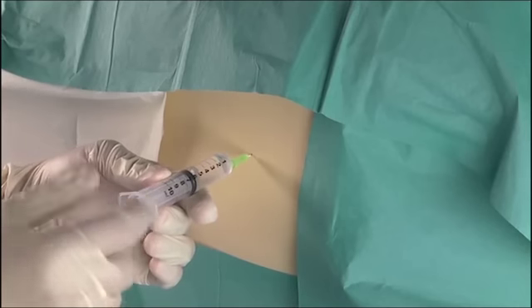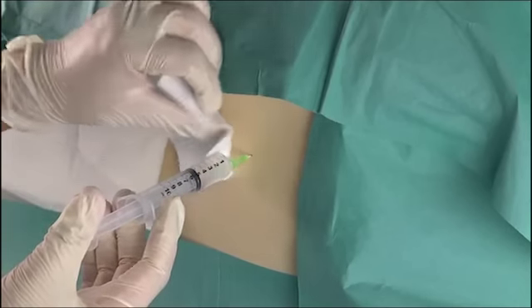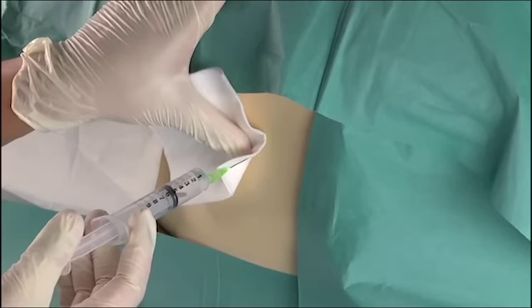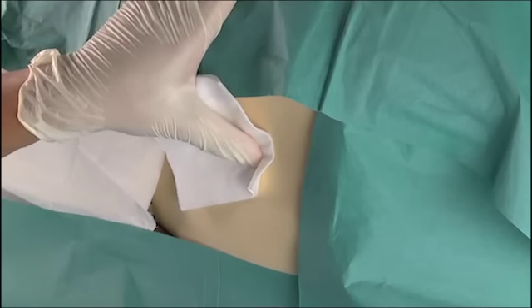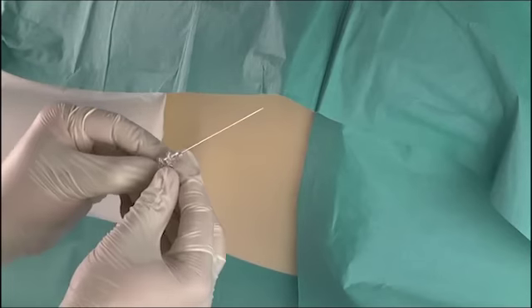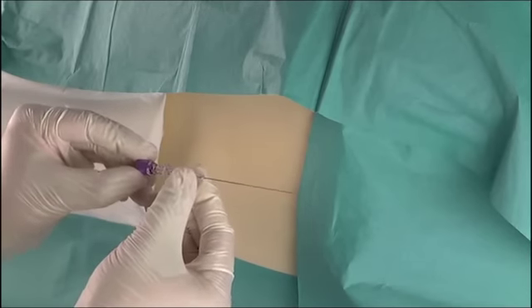2% is preferable to 1% lidocaine as it results in less subcutaneous fluid accumulation and therefore impacts less on the ability to palpate the space. Allow the lidocaine to infiltrate the subcutaneous tissue.